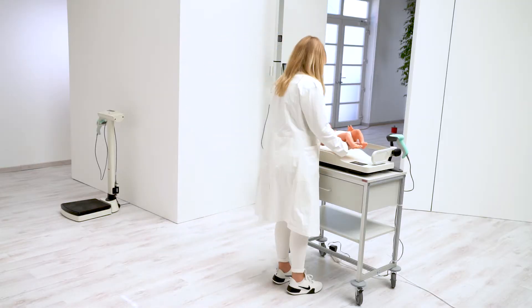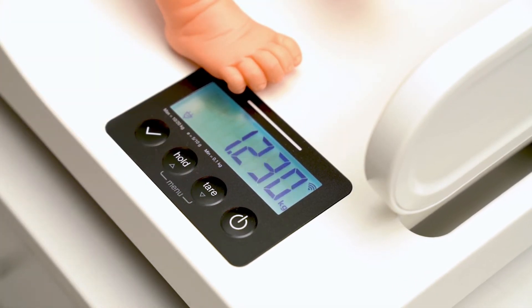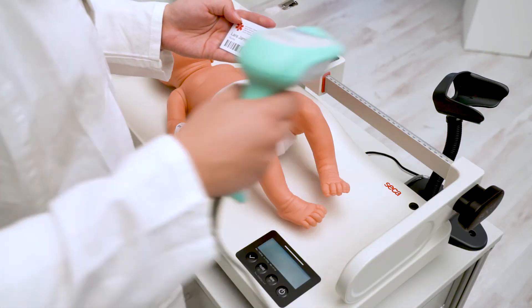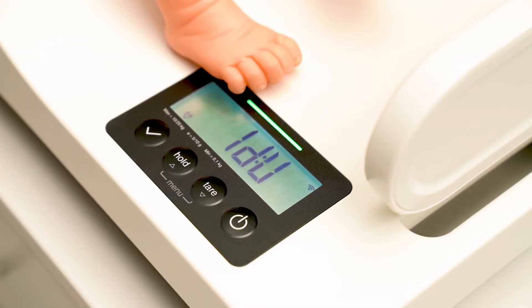The baby is placed in a secure position on the scale. The scale starts to determine the weight of the baby immediately, automatically holds the value, and confirms the stable value with a beeping sound. Simultaneously, the user can scan their ID barcode. This prepares the device to send the relevant data, which is indicated by the green LED above the display. The display of the measuring station will show this code.